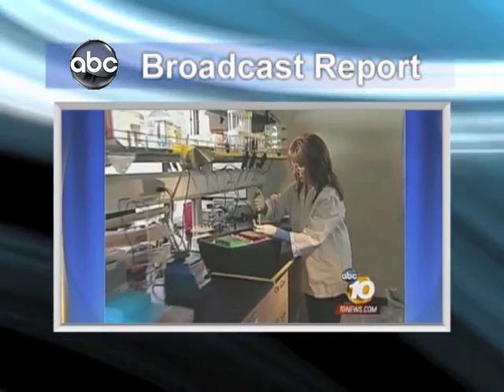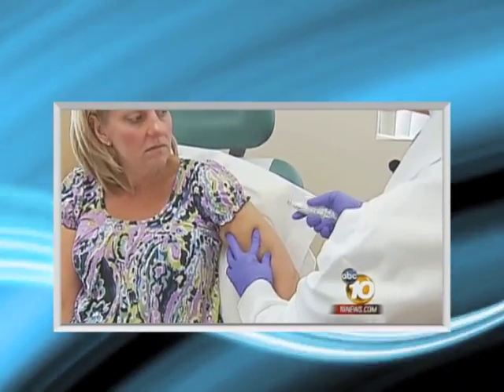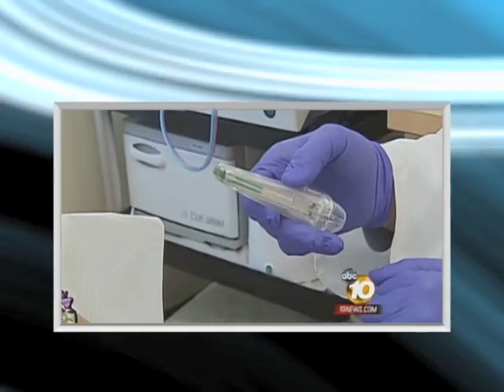An estimated 1 in 50 Americans will develop melanoma at some point in their lives. Now, the usual routine, as you may know, is a doctor finds a suspicious mole or a lesion on your skin, removes a little bit of it surgically, and it's biopsied. The test developed by DermTech means no scalpel, no cutting. I'm just going to move this over the mole. It's this simple. Instead of removing any skin surgically, the test involves using a custom adhesive to remove cells from the skin. Those cells are then tested for melanoma.